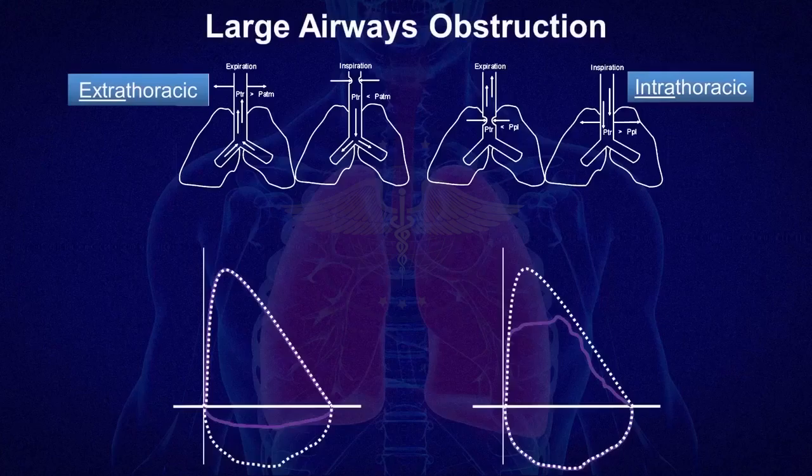So, this is what I wanted to share with you about spirometry. It is the gold standard diagnostic test for obstructive airway disease such as asthma and COPD. It not only helps you in making a diagnosis, it tells you the severity of the disease and also tells you the response to treatment once you have started these patients on appropriate pharmacotherapy.